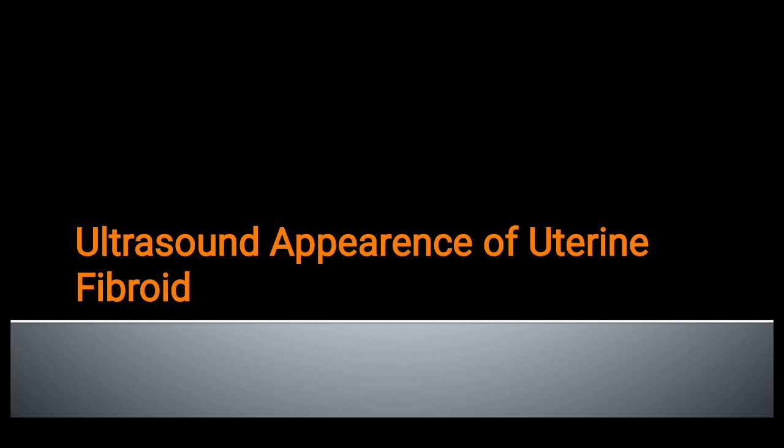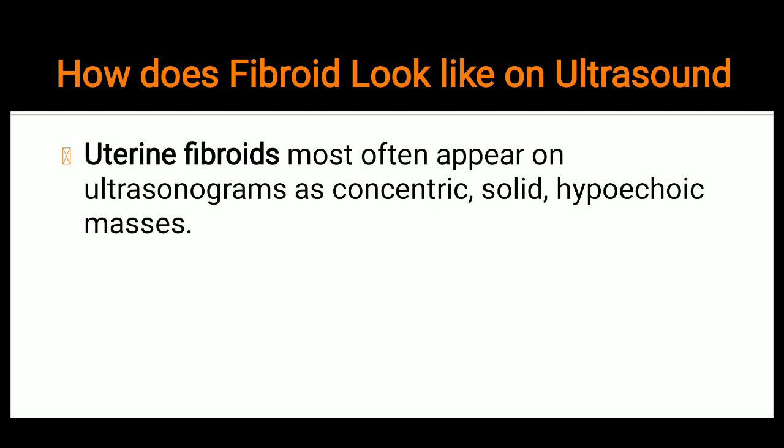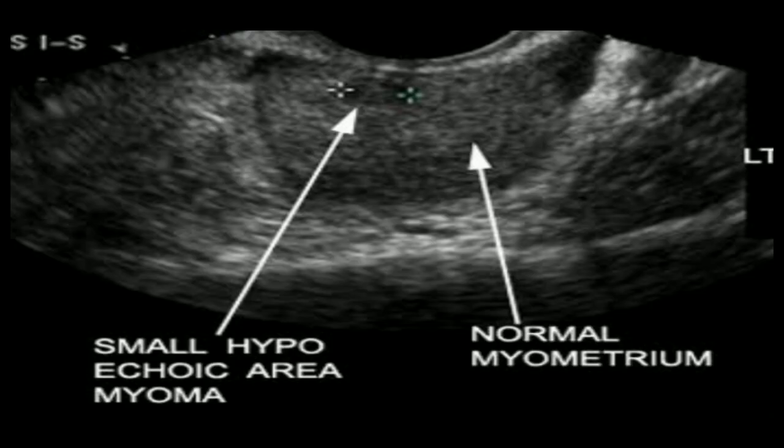There is a specific appearance which we should keep in mind while doing ultrasound of a patient with symptoms suggestive of uterine fibroid. Uterine fibroids most often appear on ultrasonogram as concentric solid and hypoechoic masses — hypoechoic meaning slightly darker in color as compared to the surrounding structure.